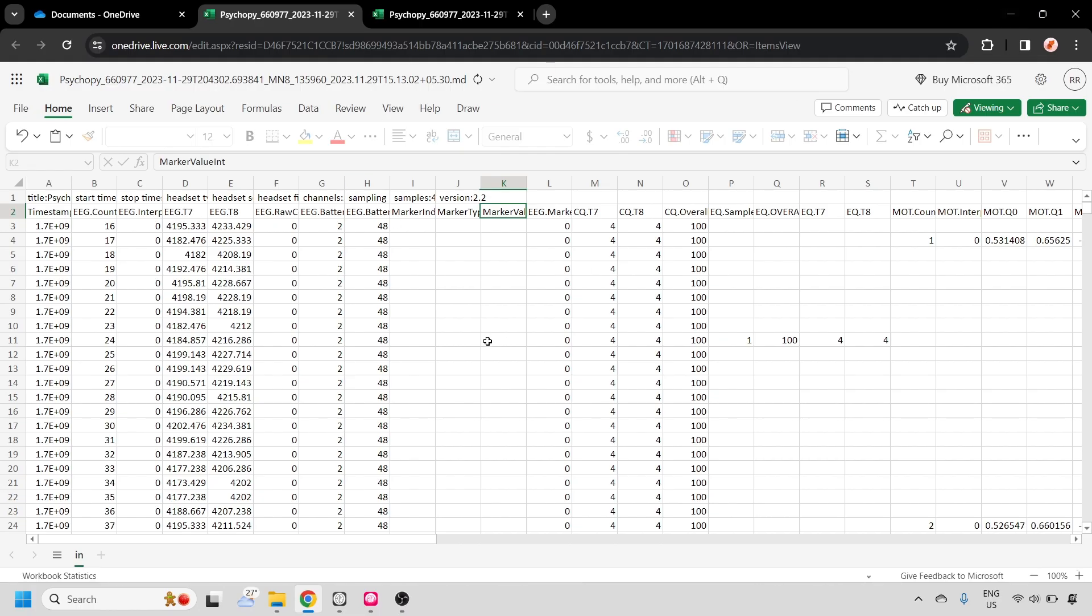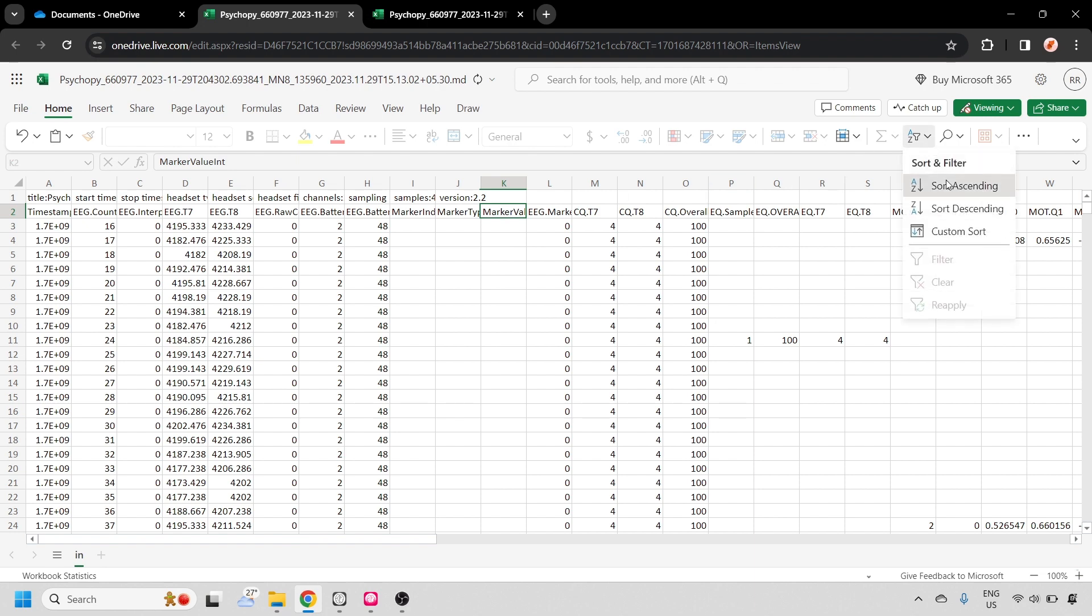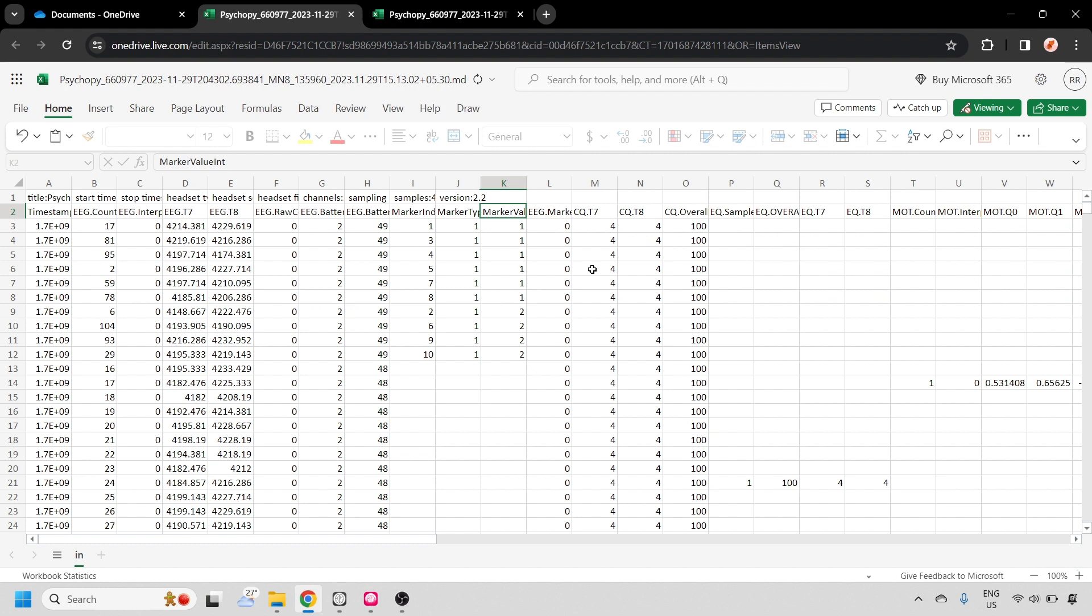If we open up the raw EEG file, we'll find a marker value column. If we just sort that, we'll see the marker values here. You'll see the low tones and the high tones sorted.